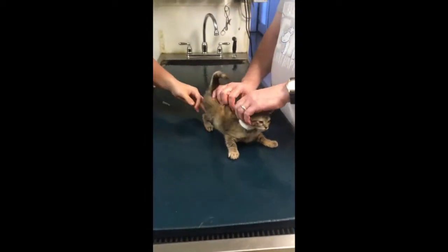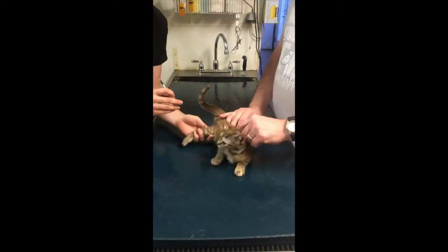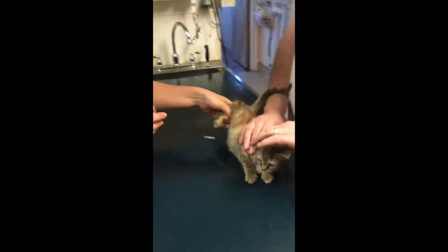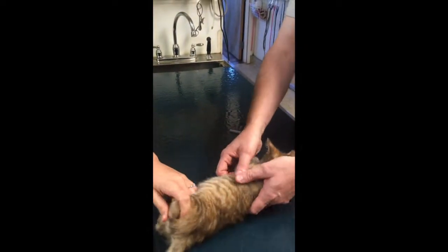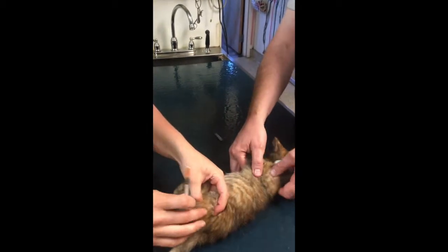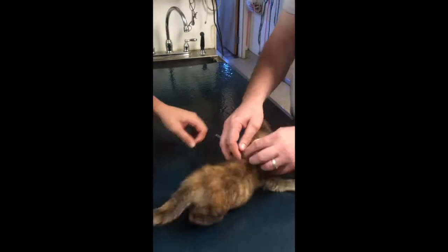What I'm going to do is go ahead, back muscle, making sure to avoid the sciatic nerve that runs back there. Come on, Zinnia. What I'm going to do is go ahead and inject. Pull back, make sure I'm not in a vessel, and give the injection. And that's our IM induction.